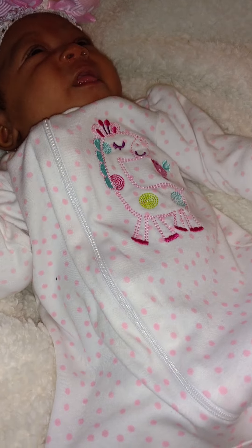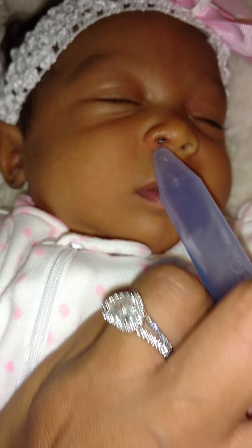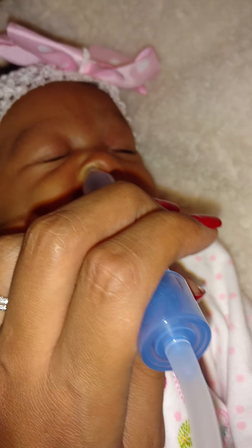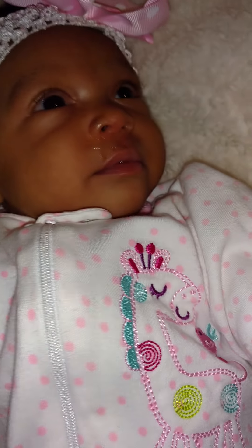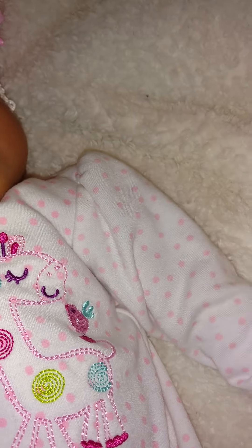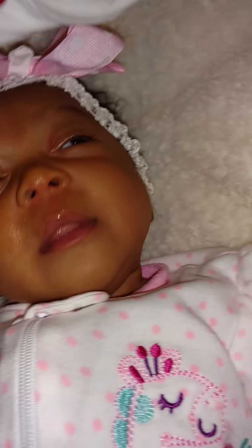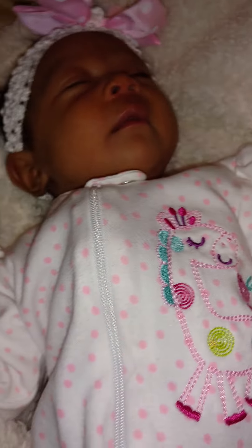Bless you. Okay, here we go. We can get a good one now. Let me see. Eww. I know y'all seen that. It's okay, Mama. See? It's right down the nose. Oh God. Okay, this is actually a napkin, which I should have a wipe. I got a little baby wipe right here. I'm still going to dab it anyways. I don't really want to wipe because I don't want her to be like... Then I just use this little napkin just to blot it dry.